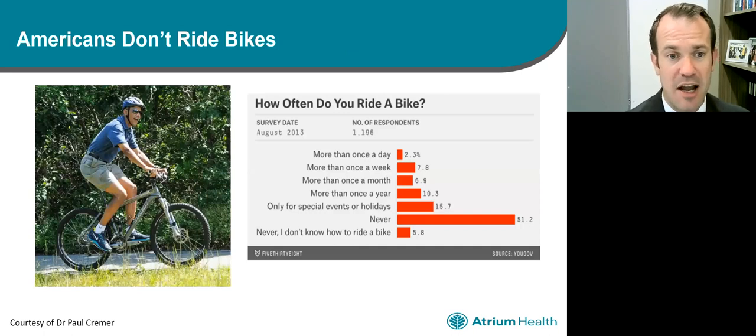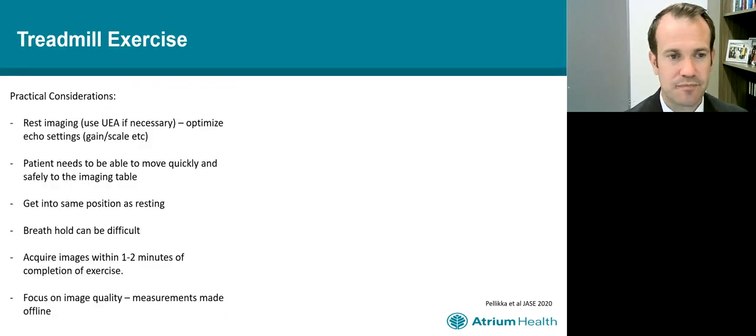This is kind of half in jest, but it's also true that Americans do not tend to ride bikes as much as Europeans, and that's one of the reasons we see that differential there. And if you're someone who never or very rarely rides a bike and you're asked to do so for a stress test, oftentimes you'll end up finishing the study more because of leg fatigue than because of cardiovascular stress.